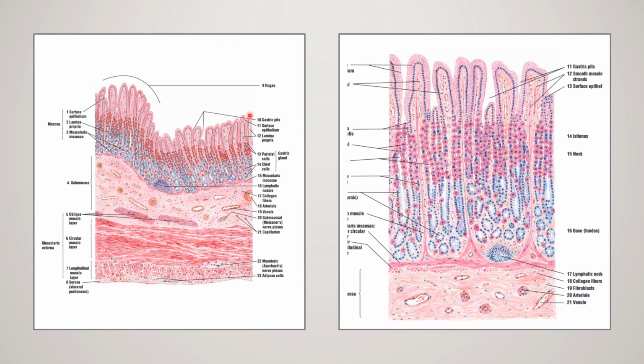Next, you have to see the mucosa. Mucosa means, as I told already, epithelium, lamina propria, and your muscularis mucosa. In the esophagus slide, we have seen the lining epithelium is non-keratinized stratified squamous epithelium. If you trace it down, your esophagus continues as stomach. At the junction of esophagus and stomach, you will be having a change of that epithelium.